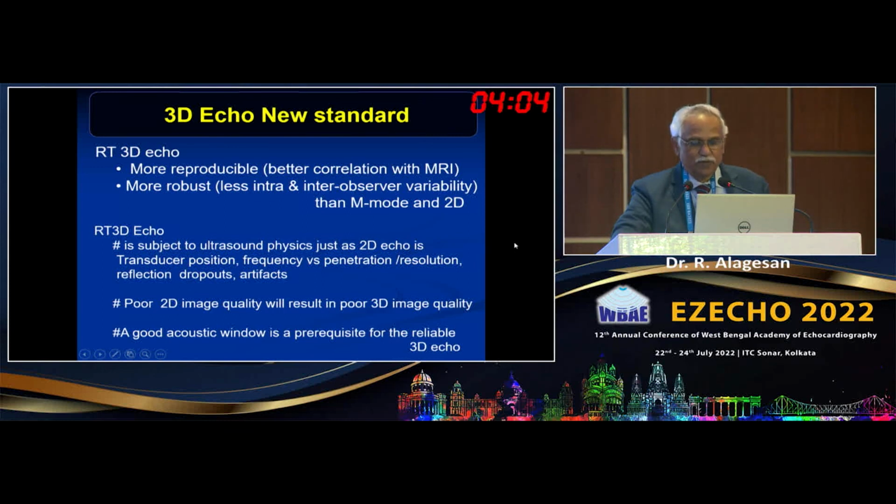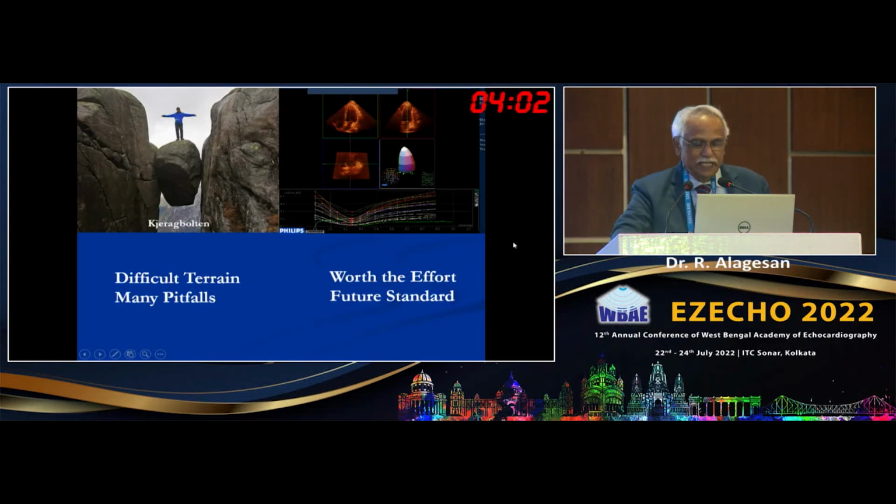So the volume rate has to be improved in the three-dimensional echocardiographic data set if it has to become more useful. Three-dimensional echocardiography is a difficult terrain with many pitfalls, but it is worth the effort, and it is going to be the future standard. Thank you.